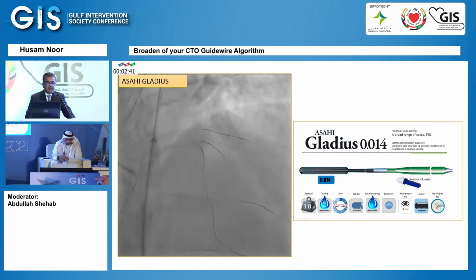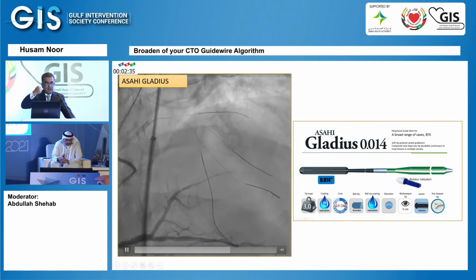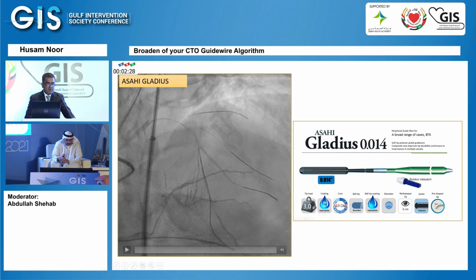So then I said, okay, I knuckled antegrade. I pulled the Gladius out from the diagonal. I tried to push it further to the proximal LAD. And then I advanced on the diagonal wire. I advanced a guide extension to do a reverse CART.